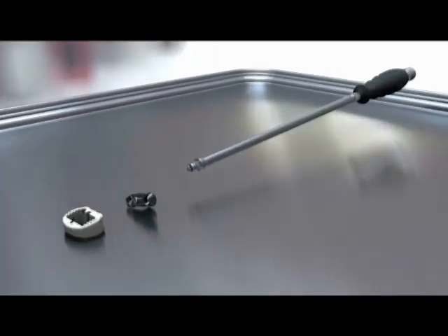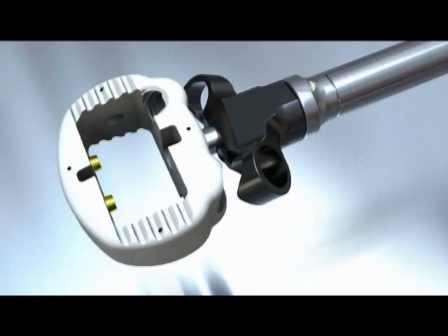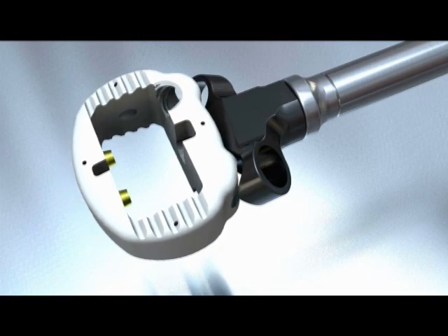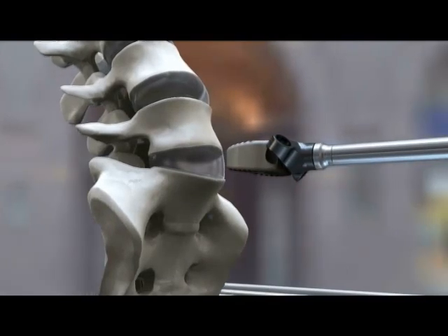It also allows the bone to be prepared for placement of the graft. Once the disc space is prepared, we then place bone graft into the disc space. In addition, we prepare the cage for implantation. The cage is a piece of plastic that's used to hold the disc space open until your body is allowed to fuse it. We do fill it with bone graft or bone graft substitutes.